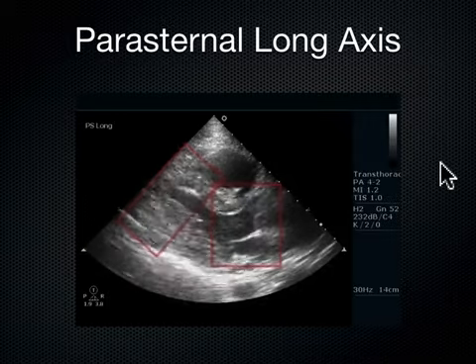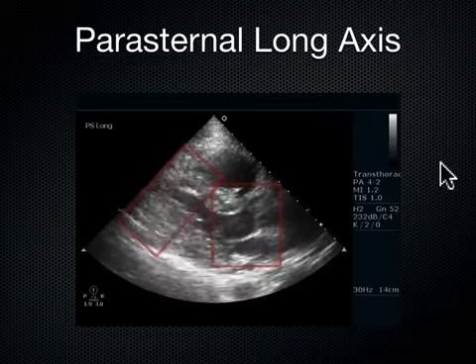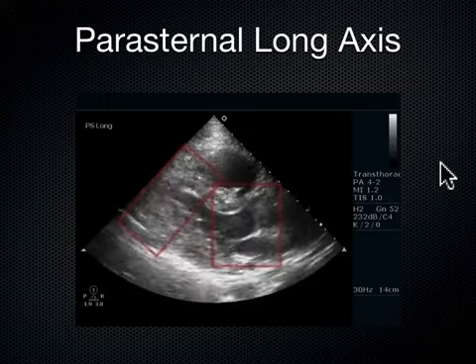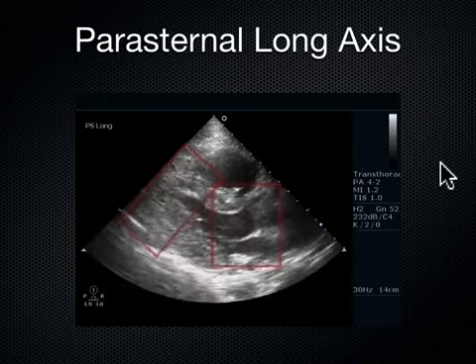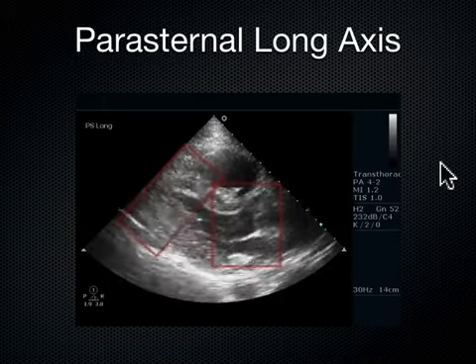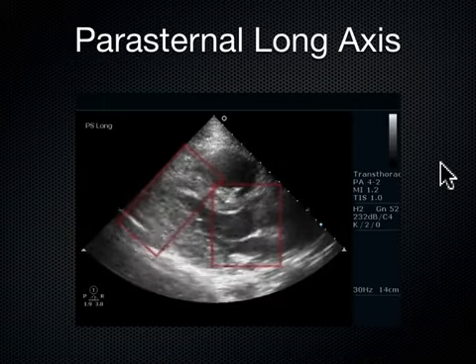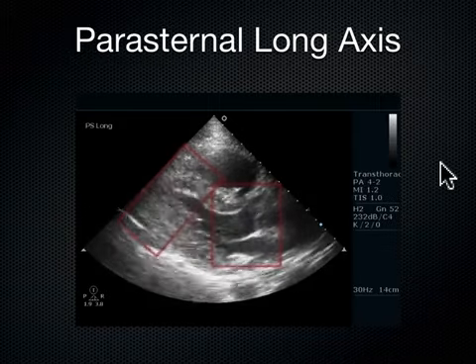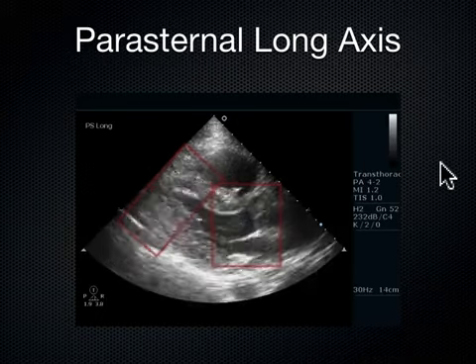Yeah, would the ratio change depending on the cross-section that you're taking, or potentially the angles? That's a good question. So how do we know that this is really, I mean, we've got this long axis through the heart. If I fan the sound from one side to the other side through this cylinderish, cone-ish thing, maybe I'm just shortening my axis, my view of it, right?